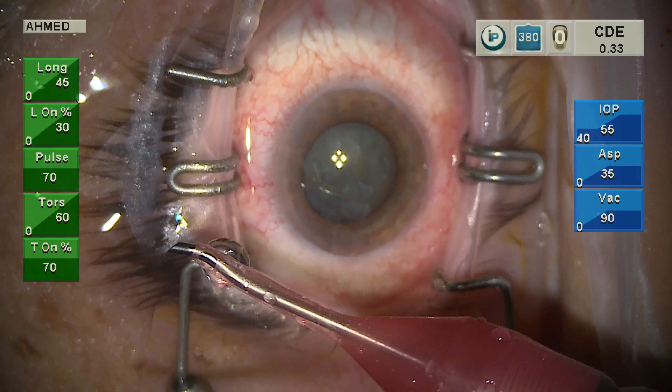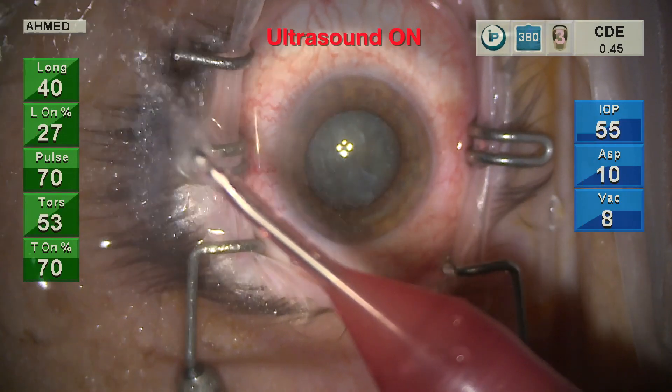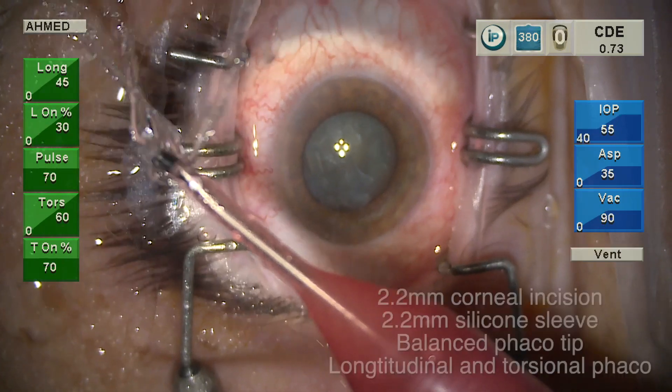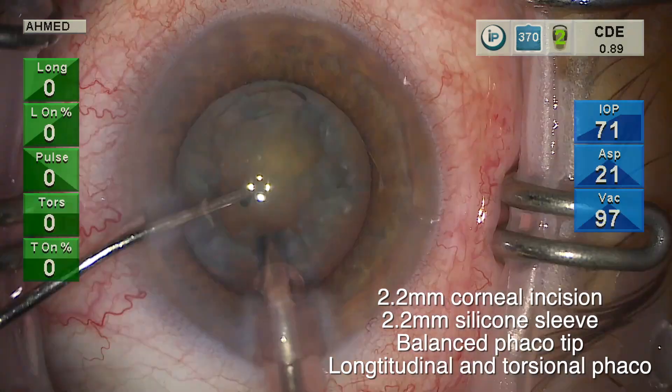This video examines ultrasound as a potential aerosol-generating procedure. You can see outside the eye the aerosol and mist formation — notice the water beads and formation of little water droplets on the surface on the sleeve outside the eye.